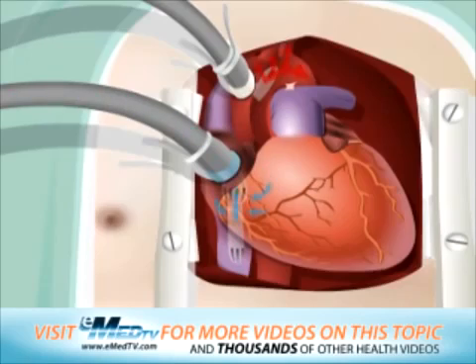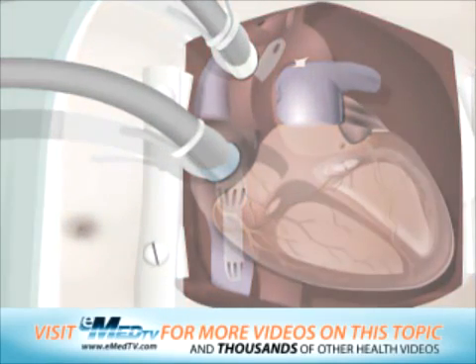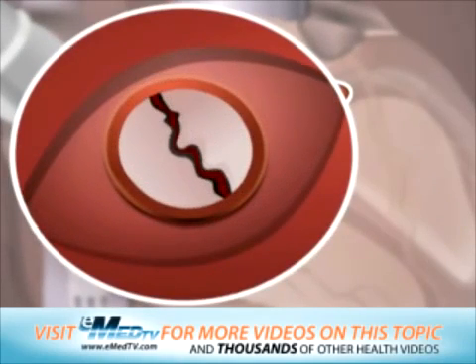After the heart-lung bypass is established, the heart will need to be cooled to keep it still. The atrium is gently opened to reveal the mitral valve.